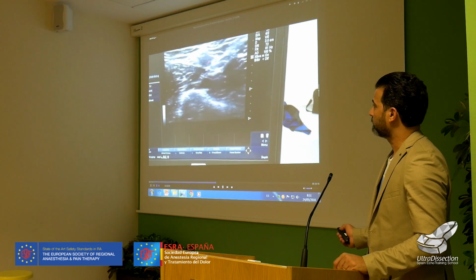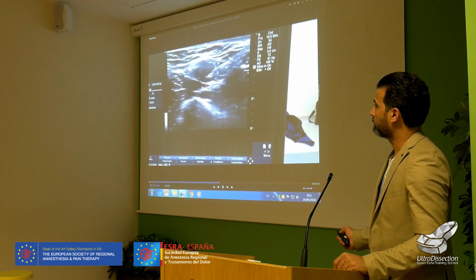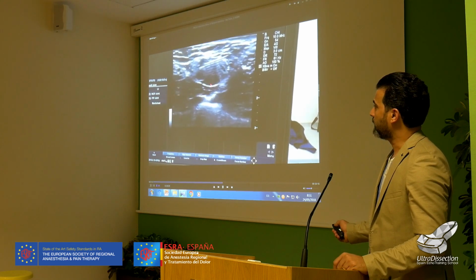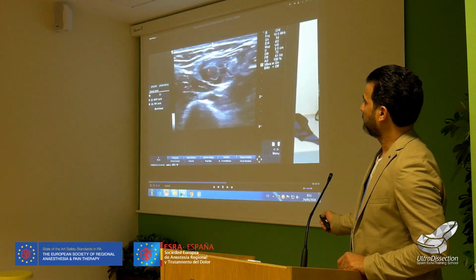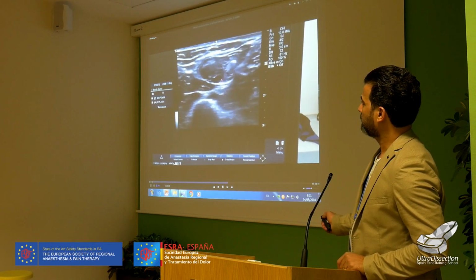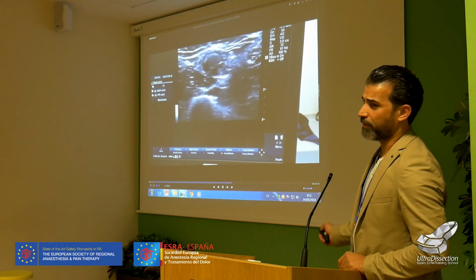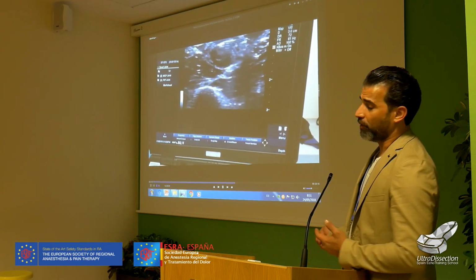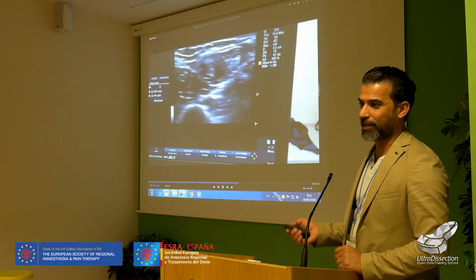Now I will have to dissect. Yes. Now the neuroma. See the nerve now. See the neuroma, very clear, and the nerve. It's painful. The neuroma in that section is so painful. But you know, we have pain management, not general anesthesia, just mild sedation of the patient.